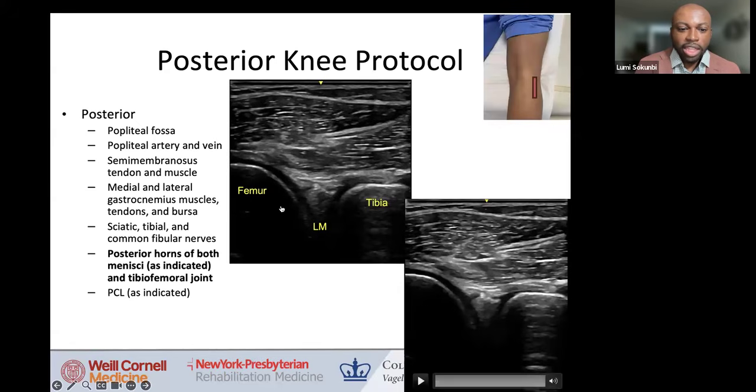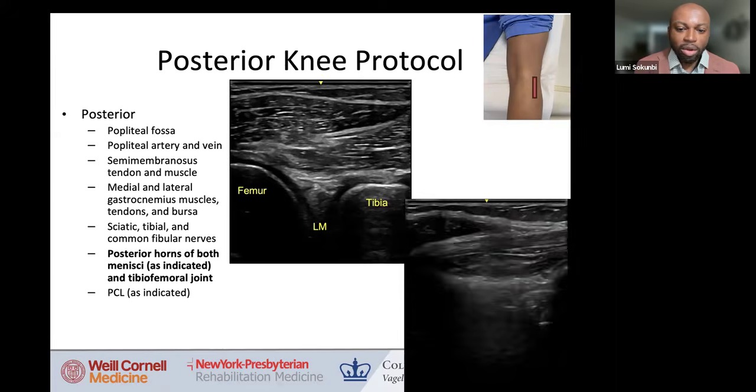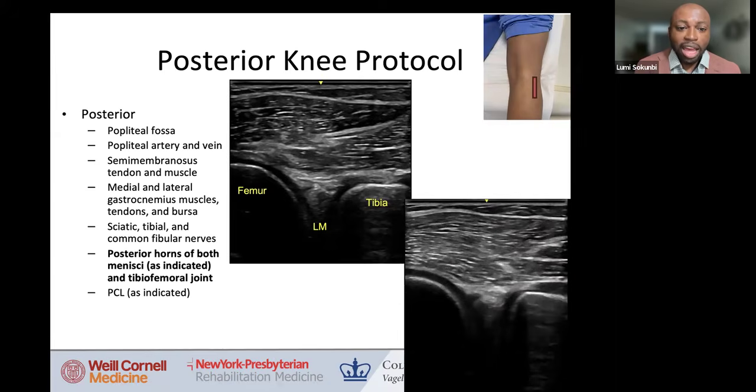The dark area here is going to be some cartilage, so that's normal to expect in that area as well. And you're really looking for any sort of cyst or major hypoechoic clefts that don't correct upon dynamic scanning or wagging and don't fill in, so you know that there could be a site of pathology there.